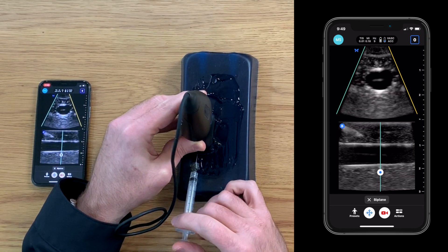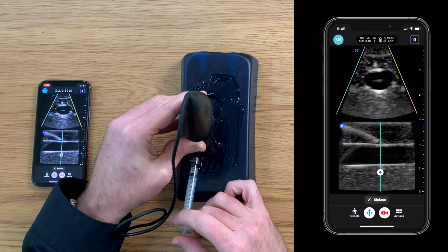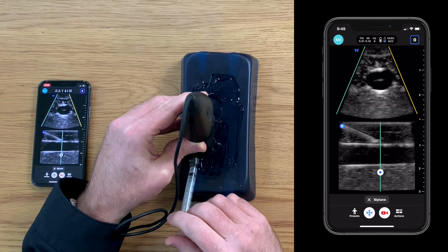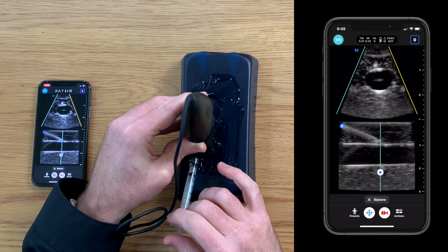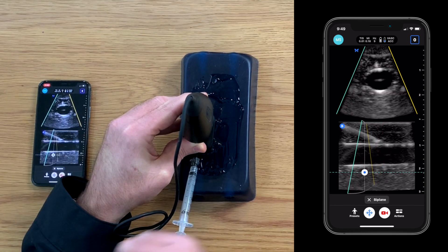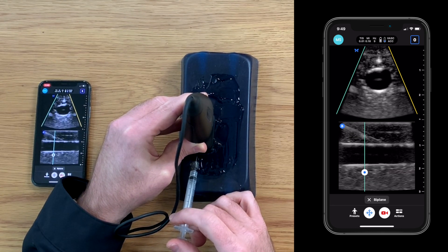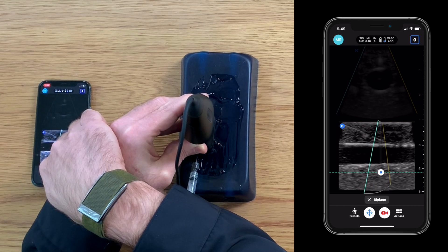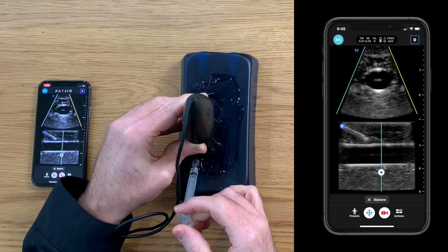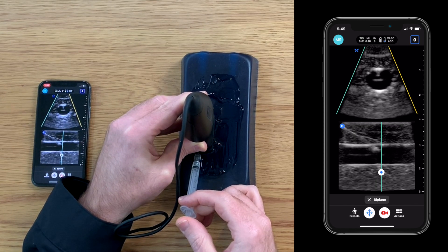This bright green vertical line corresponds to the plane at which we're seeing the short axis. So if I want to see the needle tip in short axis, I need to cross that plane. You can see now we have this bright dot on the top of the vessel, and that corresponds to the short axis image of the needle tip. If I wanted to see it sooner, I could simply slide that imaging plane closer to the needle. Let's put the plane where I anticipate intersecting the vessel — I can now direct the needle into the vessel, and I can see that I'm centered very nicely in the vessel.